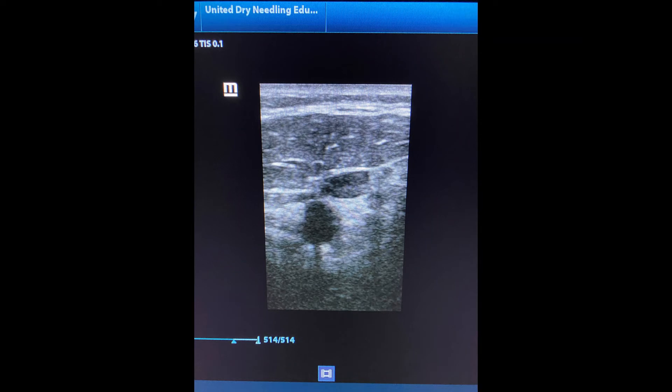Let's look at a live ultrasound of my own neck and sternocleidomastoid to look for my jugular vein. If you haven't seen a diagnostic ultrasound image, it may look like a snowstorm or a fuzzy TV. To orient you: the area at the very top of the screen is subcutaneous tissue, right beneath that is the sternocleidomastoid muscle, the top circle is the jugular vein, and the bottom circle is the carotid artery. Notably, I do not have an external jugular vein that goes on top of my sternocleidomastoid — which is why diagnostic ultrasound is crucial.